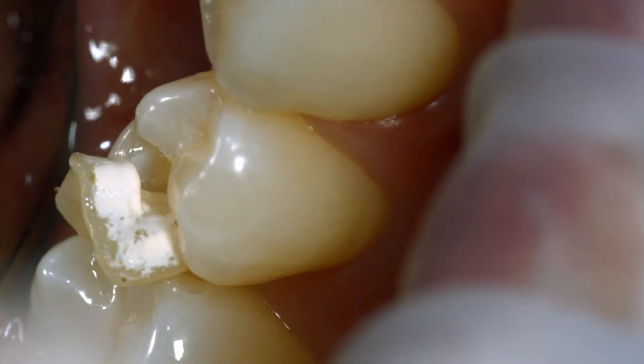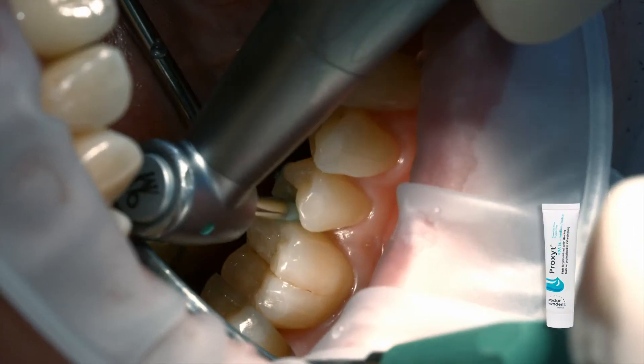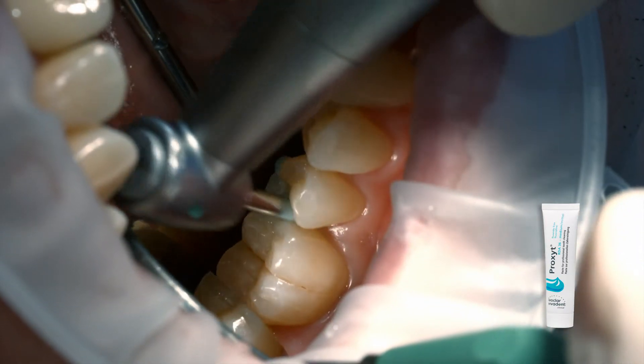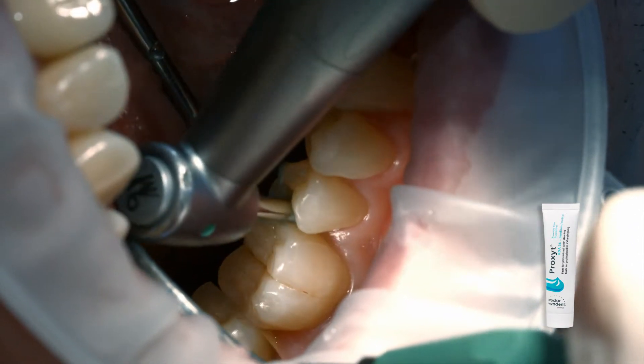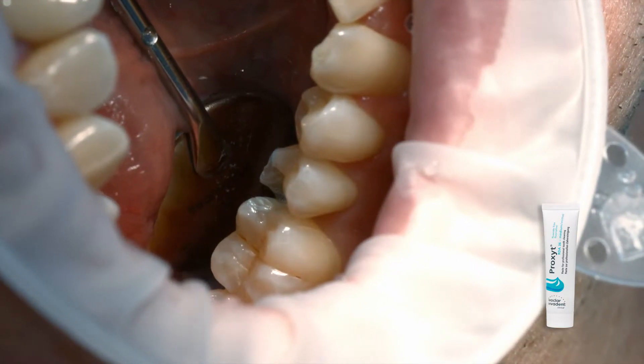Remove the temporary restoration. Clean the preparation with a polishing brush and fluoride-free cleaning paste, such as fluoride-free Proxit. This ensures that all temporary cement residues are removed.